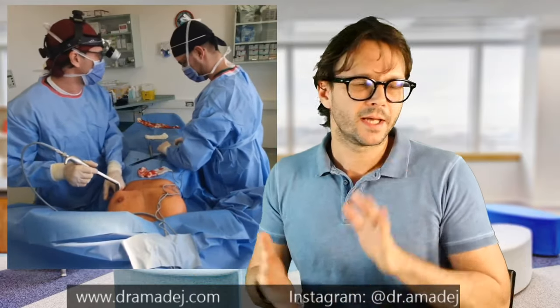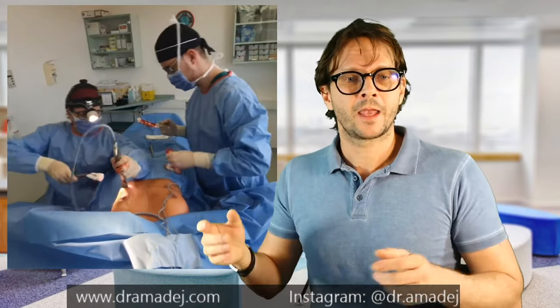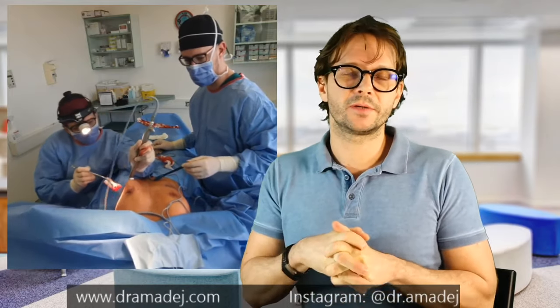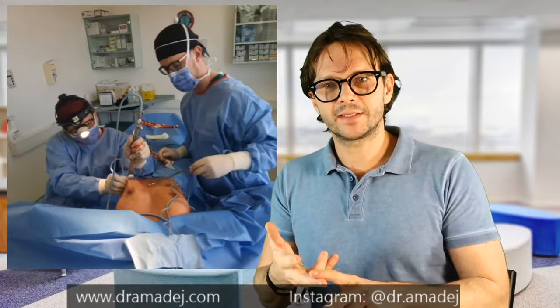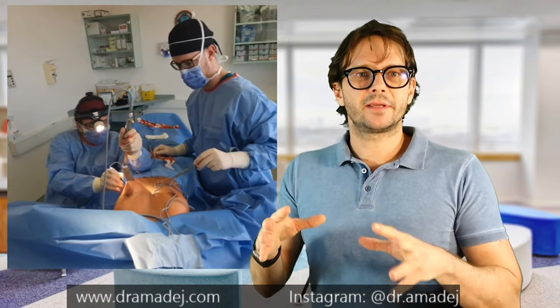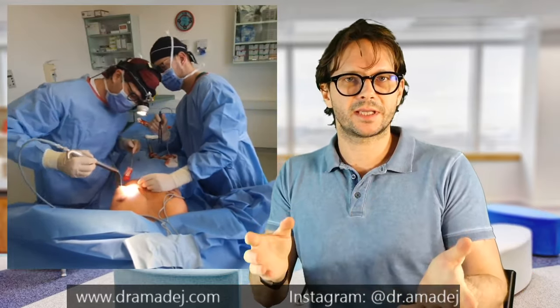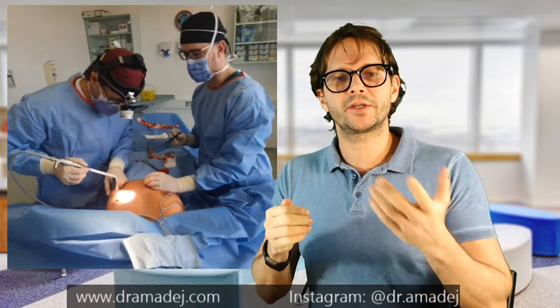Most implant sizes are always in-house, so going a little bigger or smaller is not a problem. This is also the time to speak to the anesthesiologist, who will ask the patient about their health condition one more time, ask about any previous experiences with anesthesia, drugs they take, and check the lab work — the blood exams done before surgery. If everything is fine, the patient is given some medicine to calm her down and some medicine against nausea and vomiting.